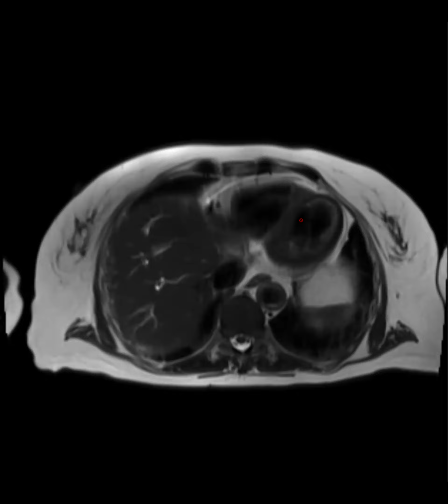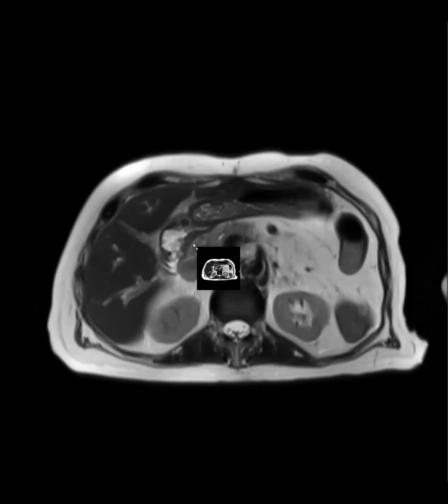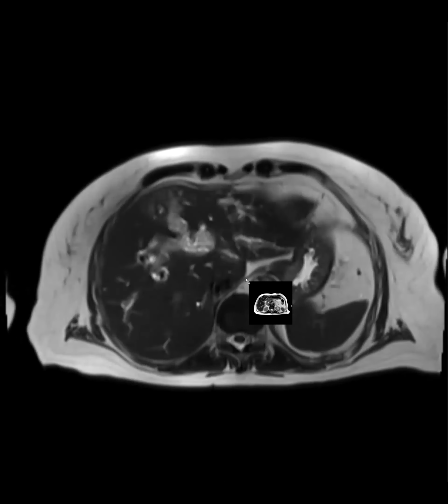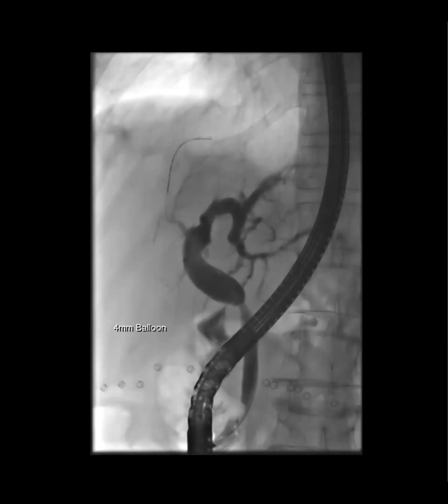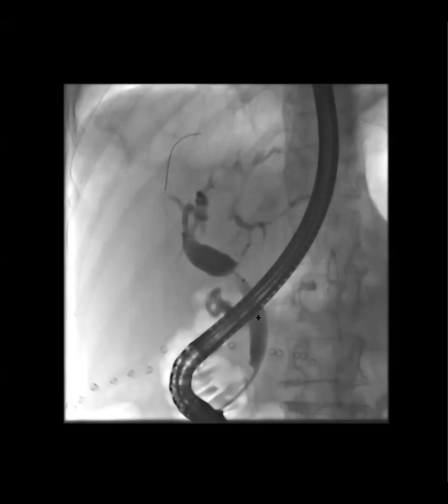And then I'll show you the MRCP. So there's a severe stenosis. There's complete flow void at the CBD anastomosis, with severe dilatation of the intrahepatic ducts, with extensive edema around the bile ducts, which was accounting for the hypoattenuation on the CT. And then we had also seen that complete occlusion of the hepatic arterial conduit. And so we went ahead and recommended ERCP. And so they did, and here's that tight stricture that they went ahead and balloon dilated.